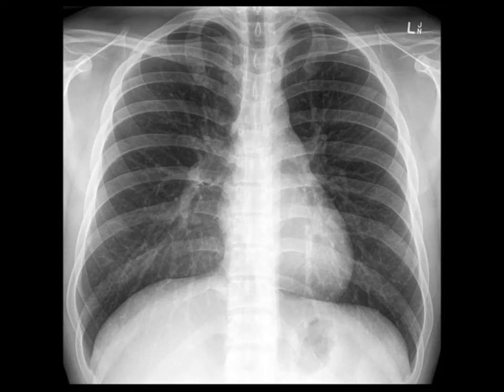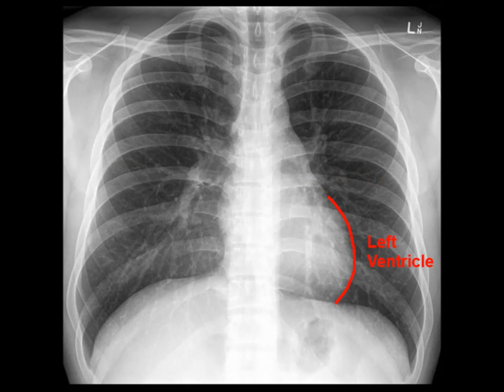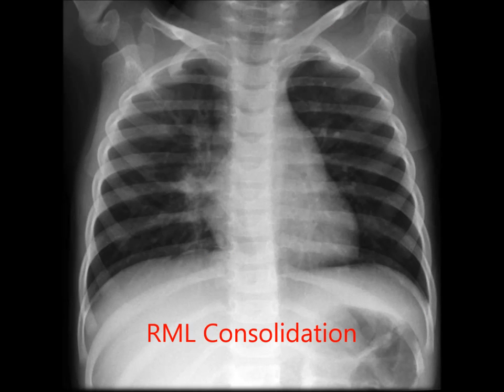E is the edge of the heart. Here you're looking for something called the silhouette sign — are the heart borders clearly defined? If not, this indicates lung consolidation is present. Remember the normal anatomy: the right heart border touches the right middle lobe, while the left heart border touches the left upper lobe. These borders may be less well defined if there is consolidation in these lobes, such as in this example of right middle lobe consolidation.